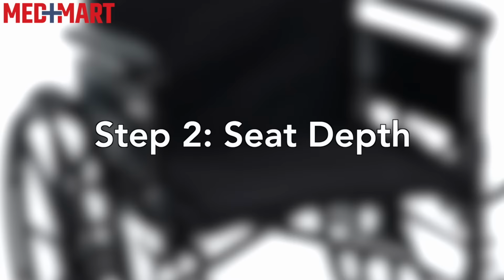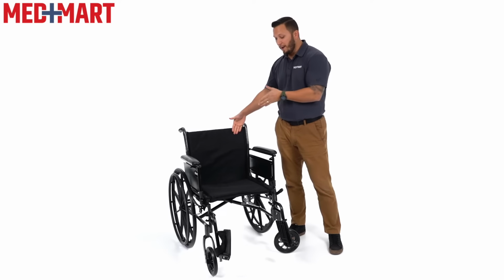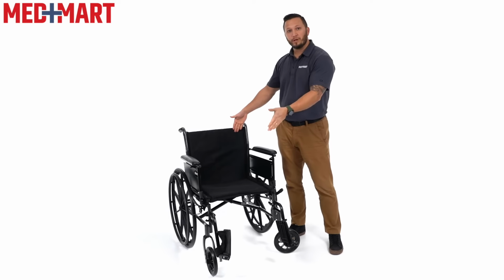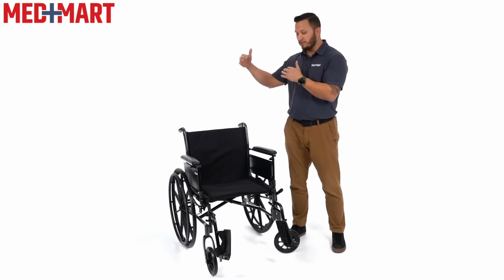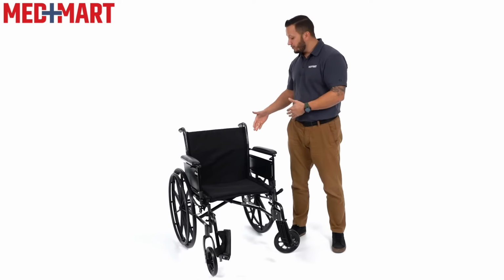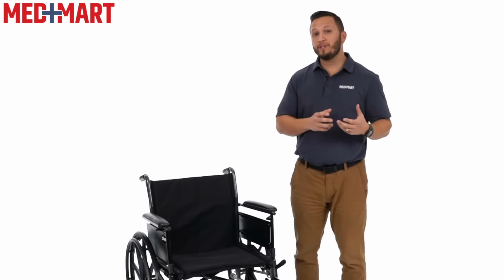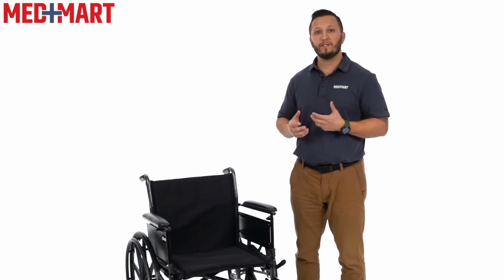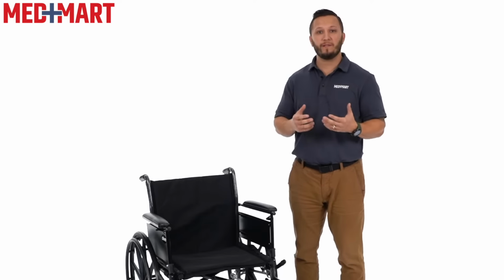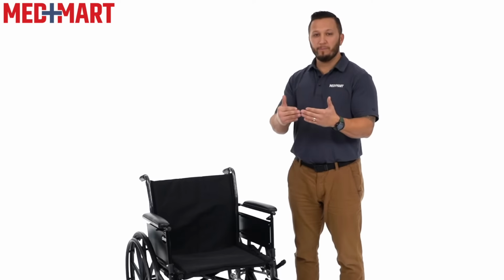The next most important wheelchair measurement that you want to consider is the seat depth. That is how deep it goes from the wheelchair back until the end of the wheelchair upholstery. The way that you would find that is have the patient sit down in the chair, and you're going to measure all the way from their back to the back of their knee. You're going to take that measurement and then subtract 2 inches. The reason that you want to subtract 2 inches is that if somebody is using their feet to propel themselves forward in the chair, you want to give your leg room to move backwards.